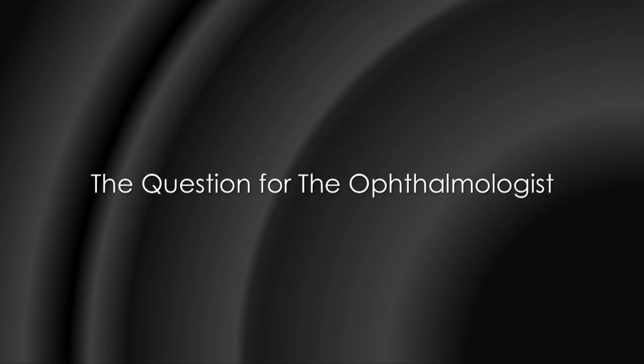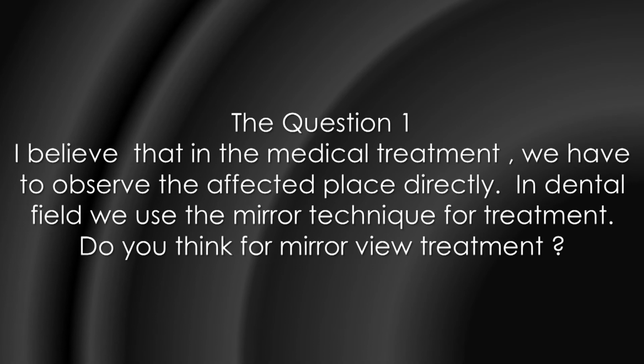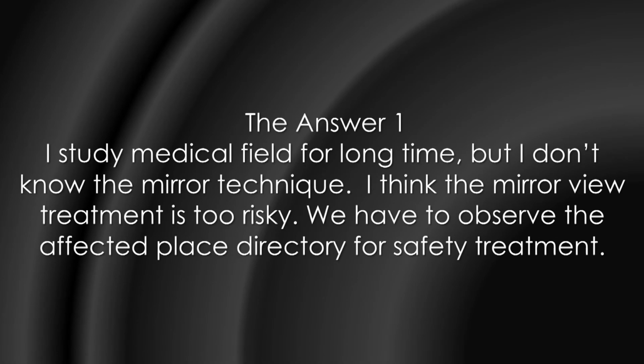The question for the ophthalmologist. Question 1. I believe that in medical treatment, we have to observe the affected place directly. In the dental field, we use the mirror technique for treatment. What do you think of mirror view treatment? Answer 1. I studied the medical field for a long time, but I don't know the mirror technique. I think mirror view treatment is too risky. We have to observe the affected place directly for safe treatment.